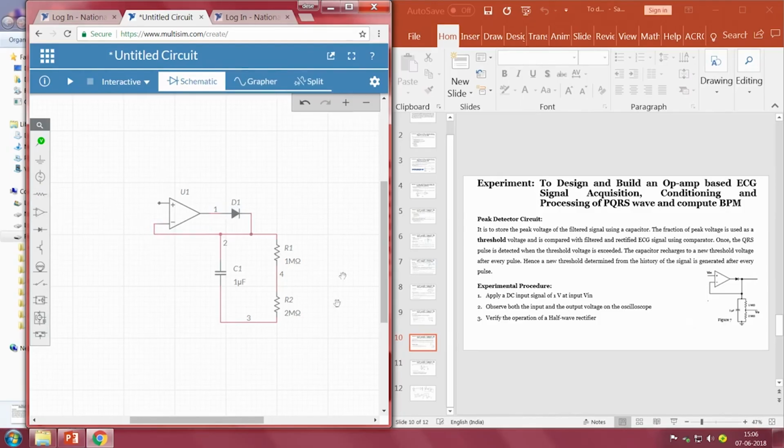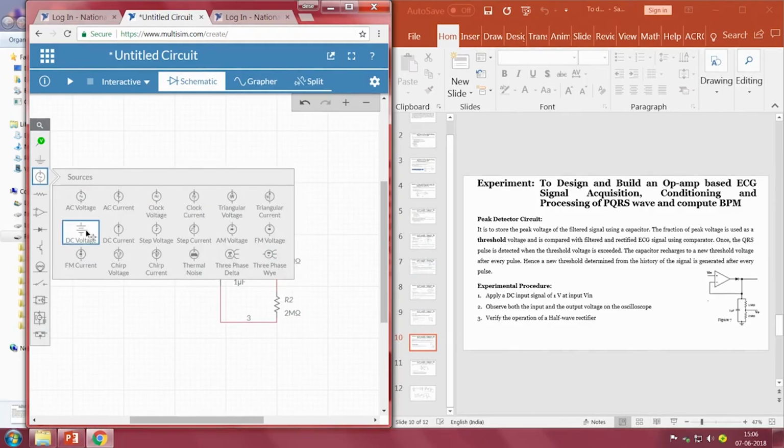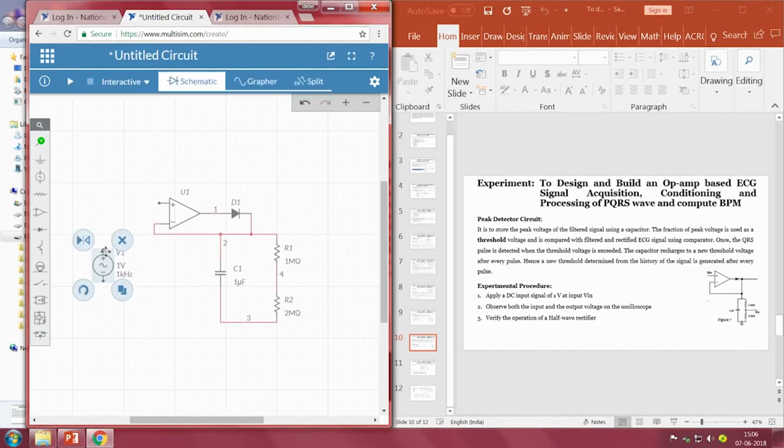In order to test the circuit, what do we use? We generally go with an AC voltage. So, let me connect the AC voltage here, and we also need a ground. So, I am taking a ground, connecting from here to here, and even this part should be ground.